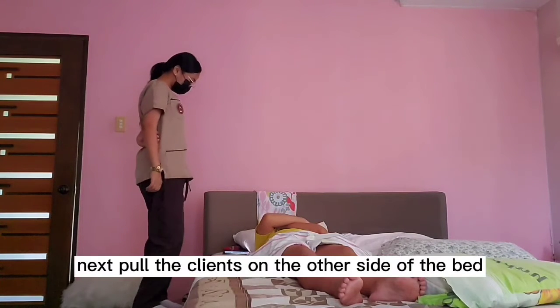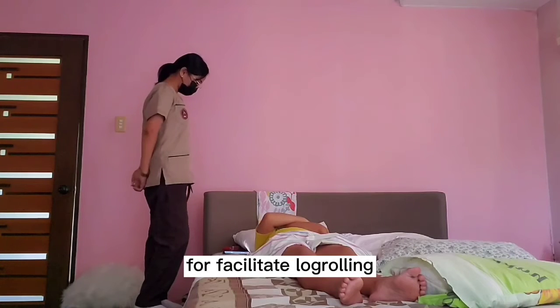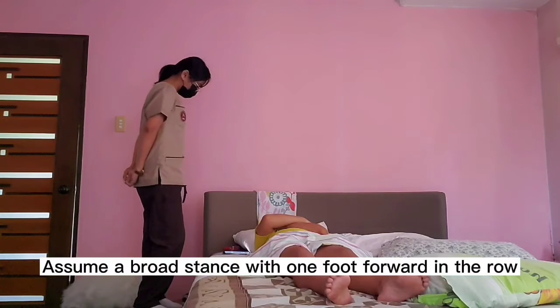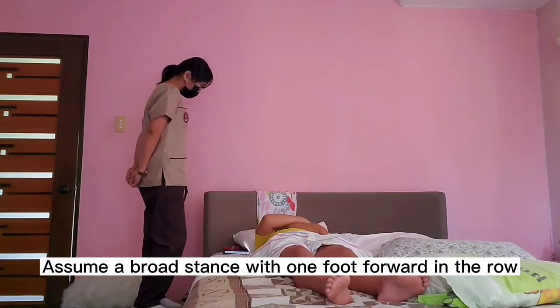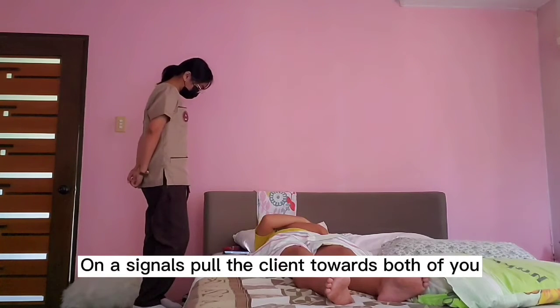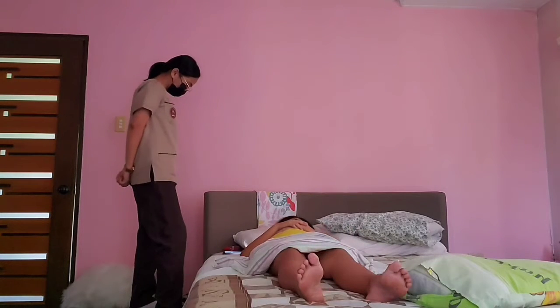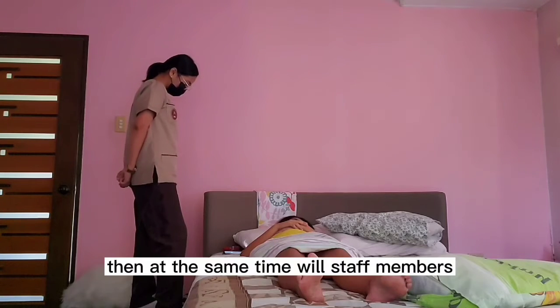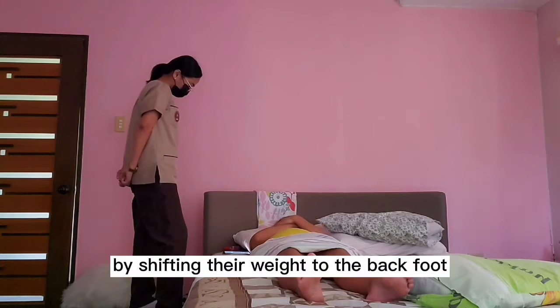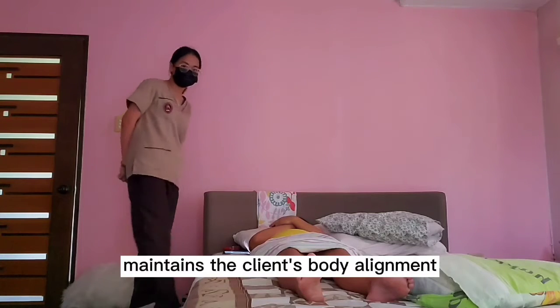Next, pull the client to the other side of the bed. Use a friction reducing device to facilitate log rolling. First, stand with another nurse on the same side of the bed. Assume a broad stance with one foot forward and grasp the rolled edge of the friction reducing device. On a signal, pull the client towards both of you. One nurse counts 1 to 3. Then at the same time, all staff members pull the client to the other side of the bed by shifting their weight to the back foot. Moving the client in unison maintains the client's body alignment.